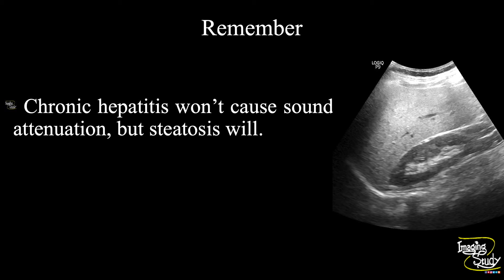The take-home message: sometimes you may face confusion between chronic hepatitis and diffuse hepatic steatosis, as both show increased echogenicity. You have to remember that chronic hepatitis won't cause any sound attenuation, but steatosis will, due to its fatty content.